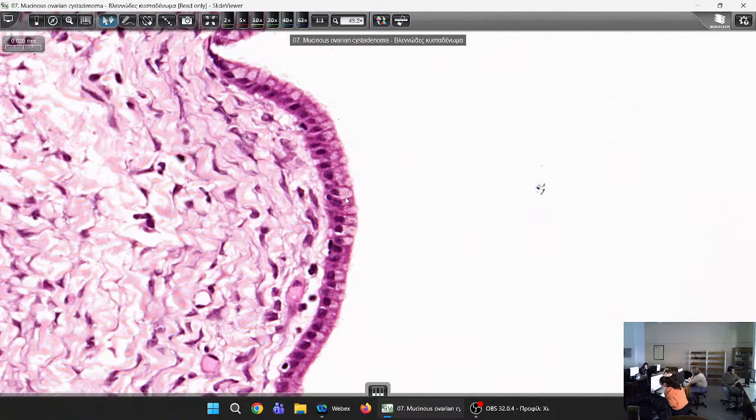In a glandular epithelium, when you see these droplets, what can it be? If you have a glandular cell and it has these small droplets in the cytoplasm, as here. It's totally benign and fully differentiated because this is a benign tumor. You see these droplets? What can this be? Mucus. So it's a mucinous cystadenoma. It is cystic in its configuration, deriving from glandular epithelium, thus we call it an adenoma, and we call it mucinous adenoma.